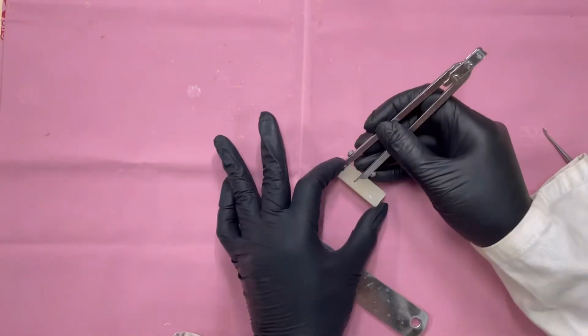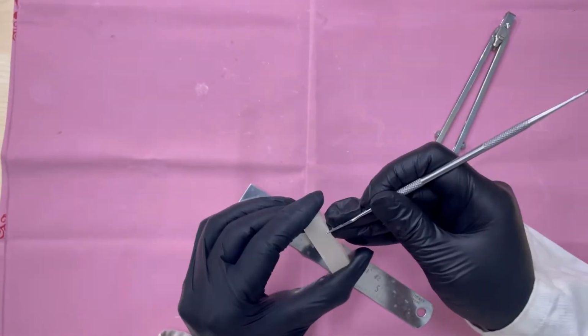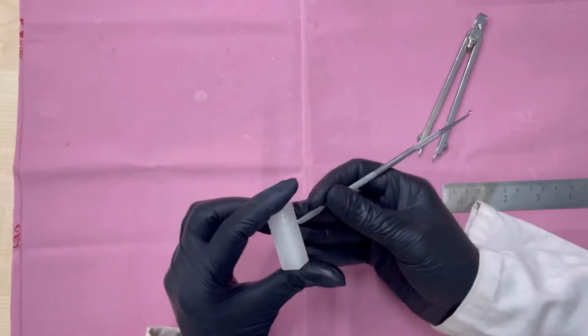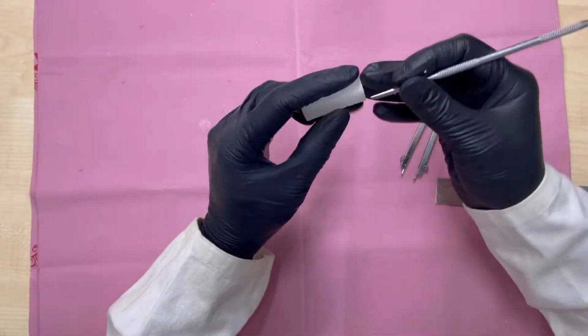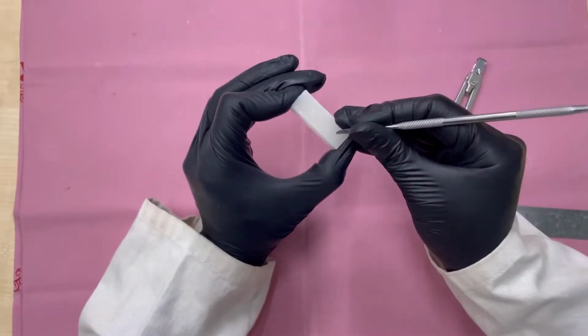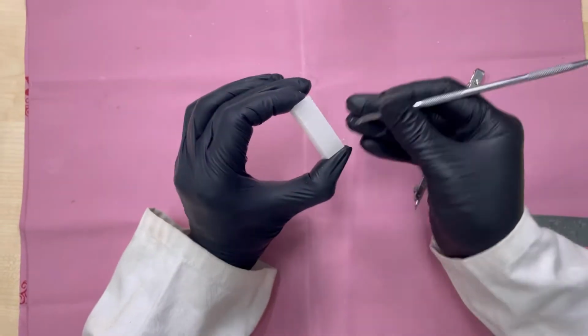Firstly, mark the length of the crown, which is 10.5 mm, on all the surfaces of the wax block. Then divide the crown into cervical, middle and incisal thirds. Now mark the midlines. Now we will mark the aspects, which are labial, palatal, mesial and distal.